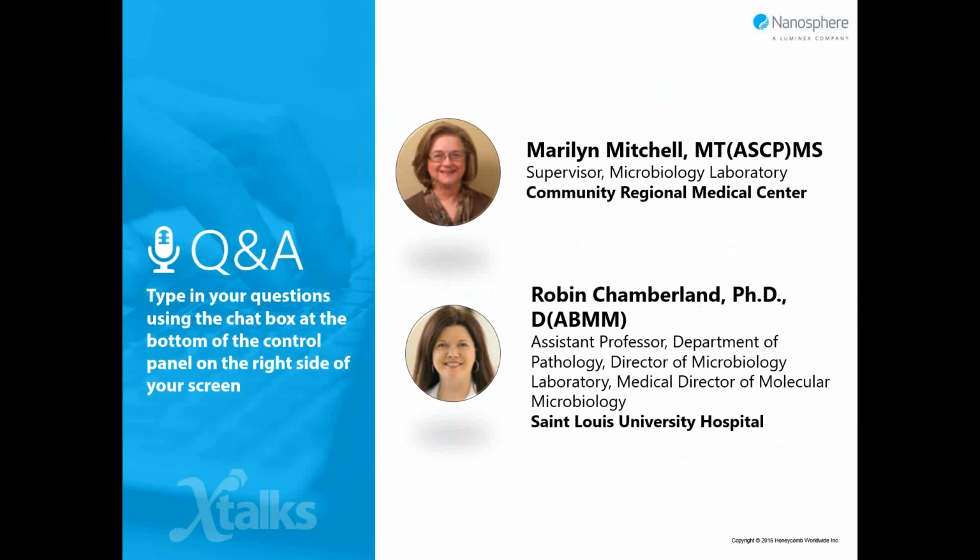Sure. So I should clarify that a little. If your patient is going home, regardless of this result, then we don't think that this test is a good use of resources. If you're using this for your decision of whether to admit or not, then yes, we can run that. So when we get these ordered from the ED, which isn't a lot because our providers down there have a pretty good idea of how we use this test now, then it's really just we call them and try to better understand. We just don't want to misuse it by running an expensive test on a patient who they don't feel is sick enough to be admitted.